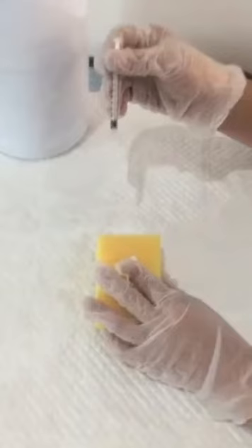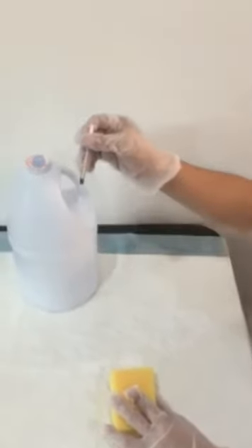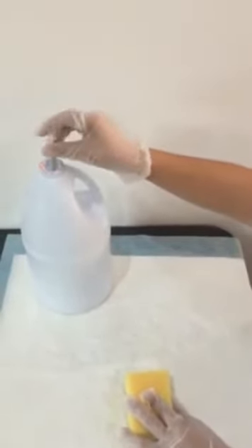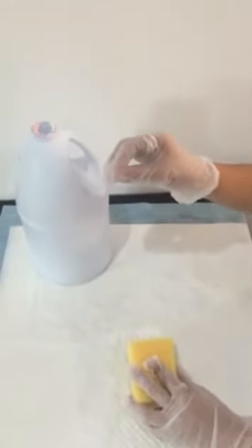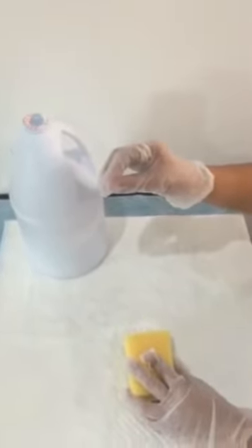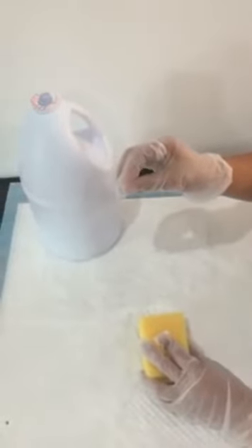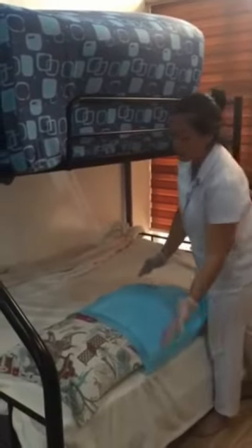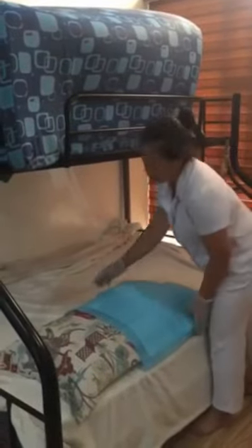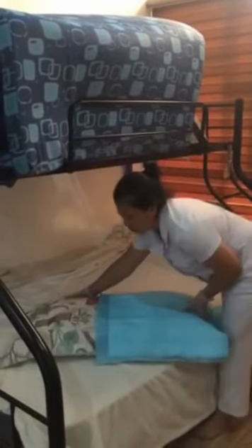Dispose of supplies appropriately. Activate the needle safety device or discard the uncapped needle and attached syringe into designated receptacles. Proper disposal protects the nurse and others from injury and contamination. The CDC recommends not recapping the needle before disposal to reduce the risk of needle stick injuries. Assist the patient into a comfortable position. Flip down the medication ticket if not using EMR.